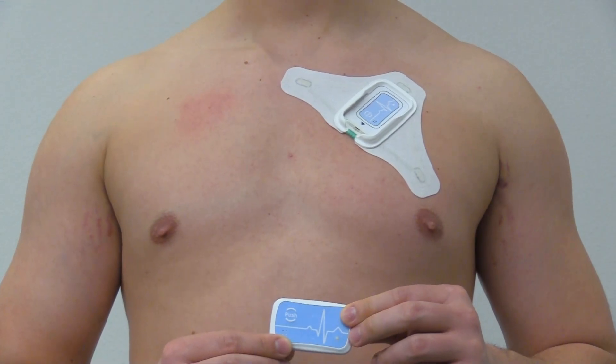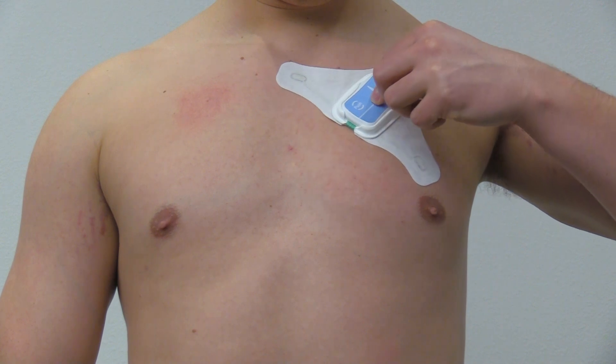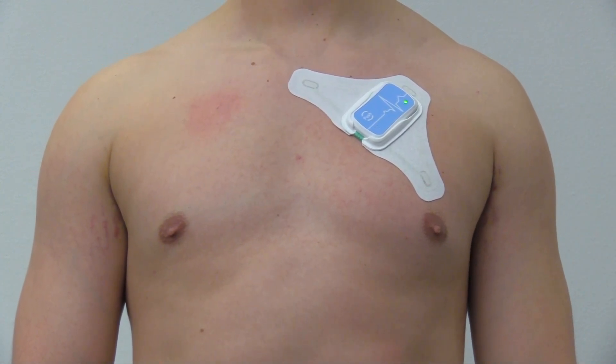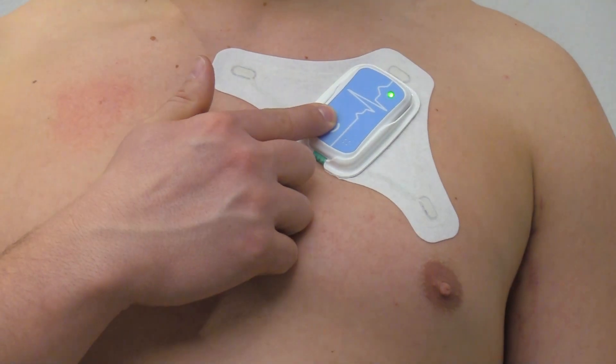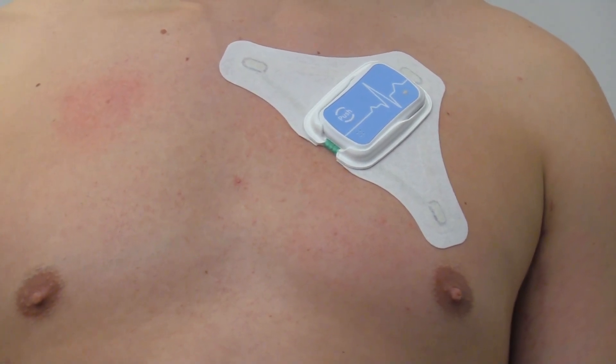Slide the Trident 30 monitor into the patch electrode until it snaps in place. A green light will flash and turn off, indicating the device is successfully monitoring. Check the monitor's status by briefly pressing the button on the monitor — a green light should flash five times to indicate proper connection.